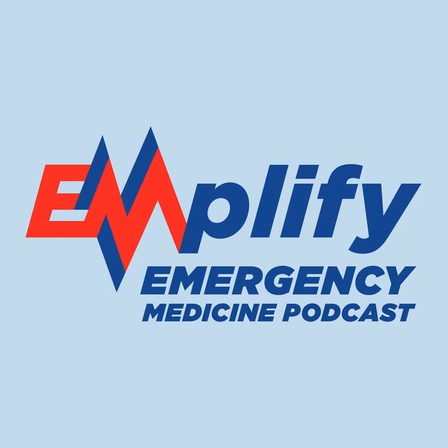With these patients, because without ARDS, 6 and 8 milliliters per kilogram appear safe, I would likely choose 8 milliliters per kilogram just to get them a slightly higher minute ventilation because it's still a safe lung-protective tidal volume. And then do a substantially higher respiratory rate to keep them breathing off that CO2 until you've had time to resuscitate them and fix their underlying metabolic acidosis, which then will allow you to decrease their minute ventilation.